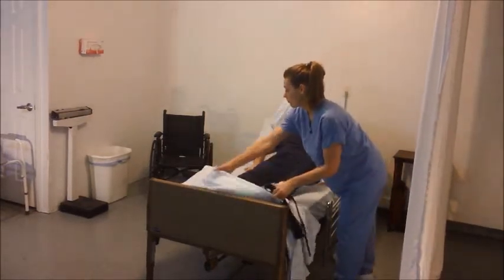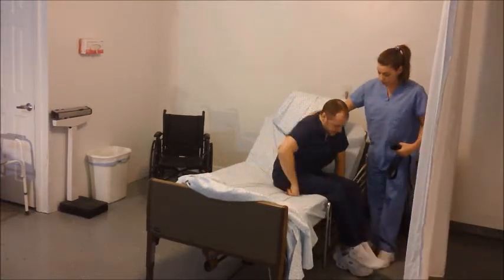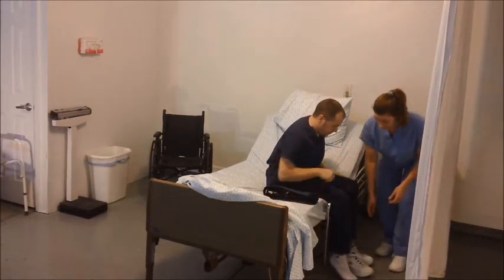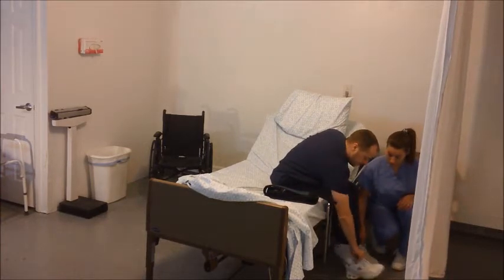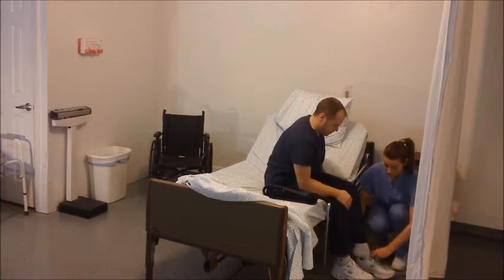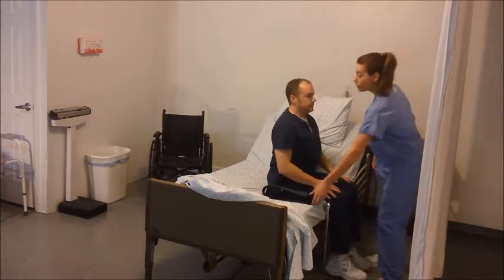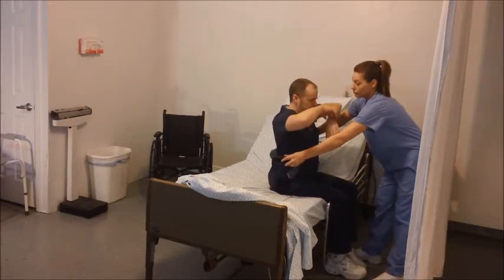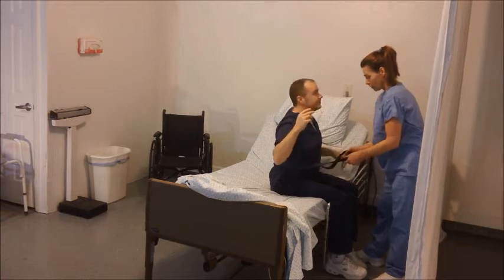Provide signal or cue to resident before assisting to stand. Assist resident to stand while holding onto the transfer gait belt without holding belt only at the front or only at nearest side. Ask about how resident feels upon standing. Walk resident while standing to the side and slightly behind resident. Provide support while walking resident with an arm under resident's back holding transfer gait belt.